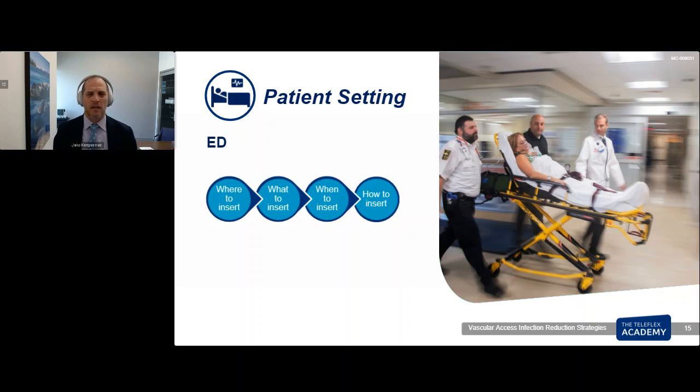What about placing PICC lines in the emergency department? I say no. PICC lines are never a resuscitation line. There's no such thing as needing a stat PICC line. It's long and skinny. It does not allow for adequate resuscitation, and it is not in the patient's best interest. So place the central line if needed.